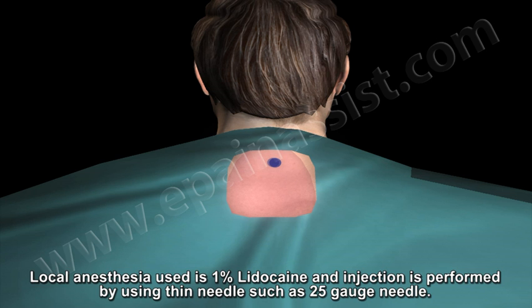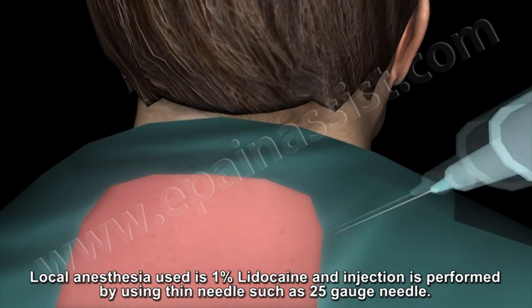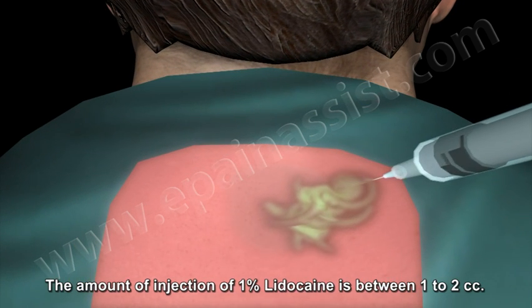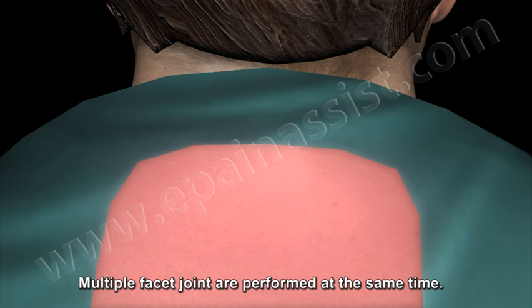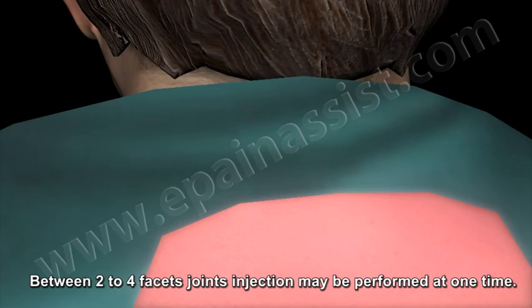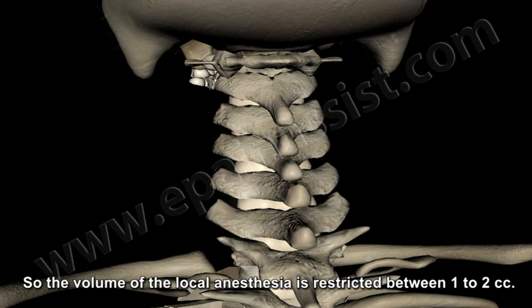Local anesthesia used is 1% lidocaine, and injection is performed using thin needles such as a 25 gauge needle. The amount of injection of 1% lidocaine is between 1 to 2 cc. Multiple facet joints are performed at the same time. Between 2 to 4 facet joint injections may be performed at one time. So the volume of the local anesthesia is restricted between 1 to 2 cc's.